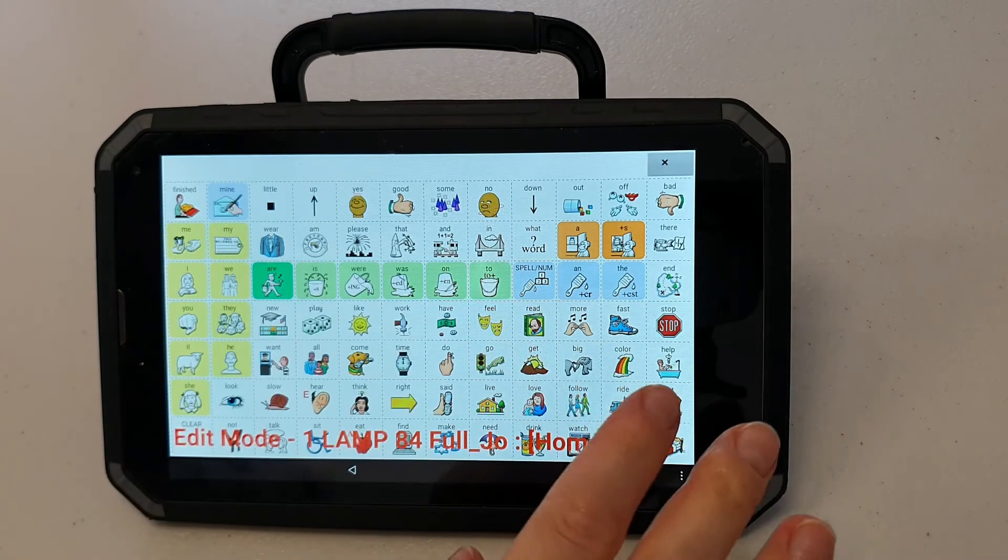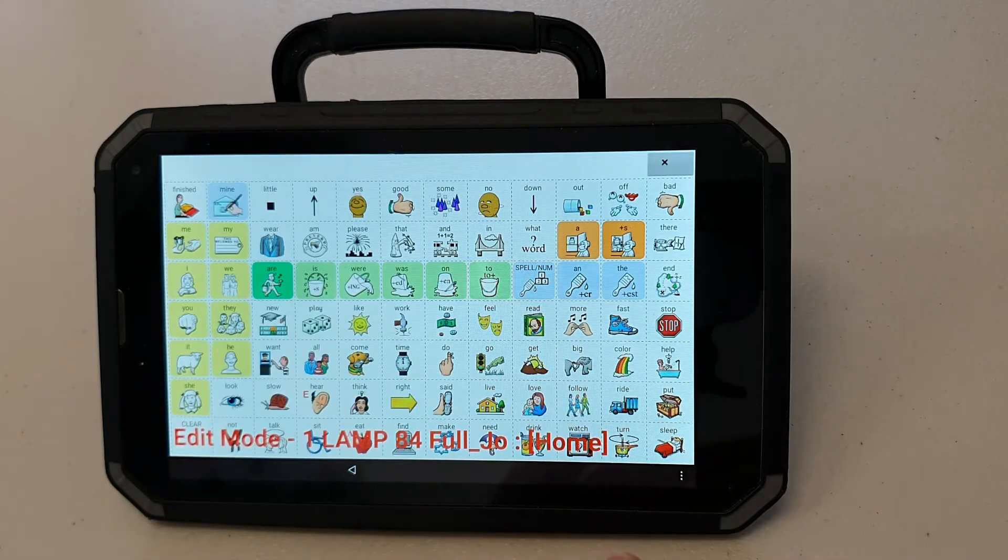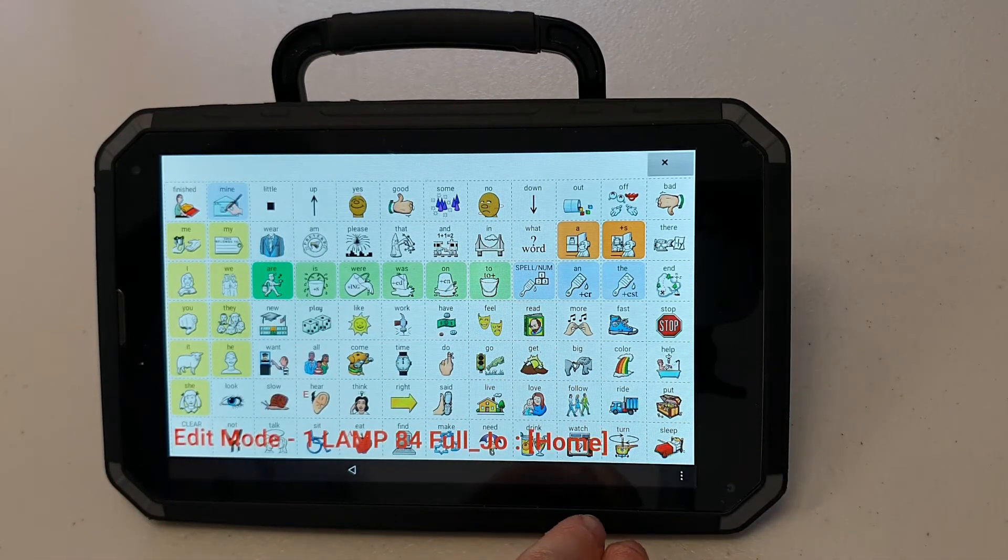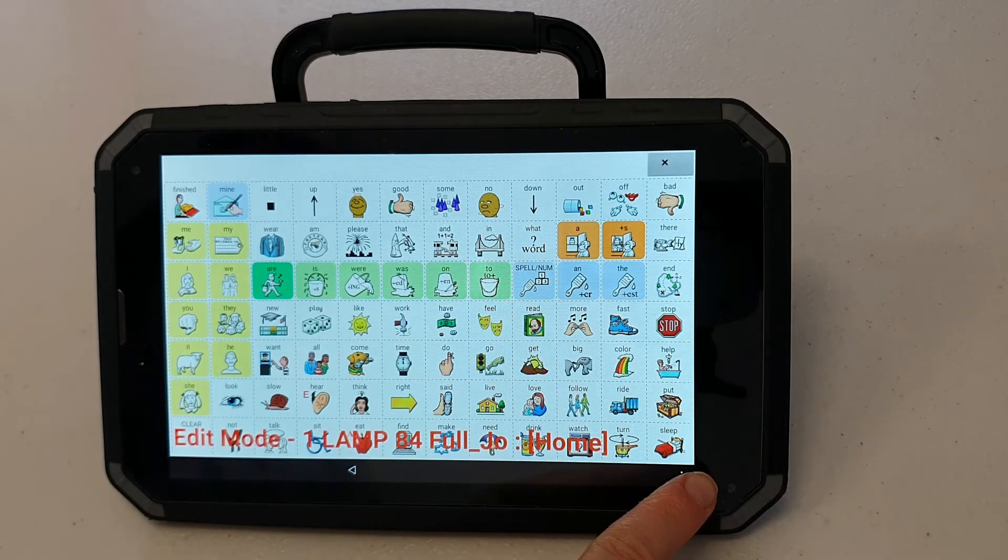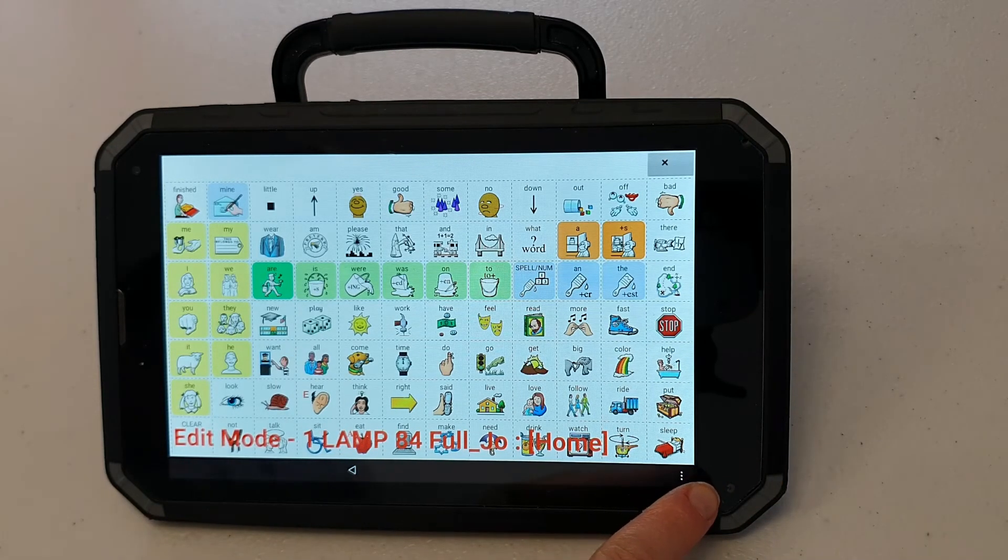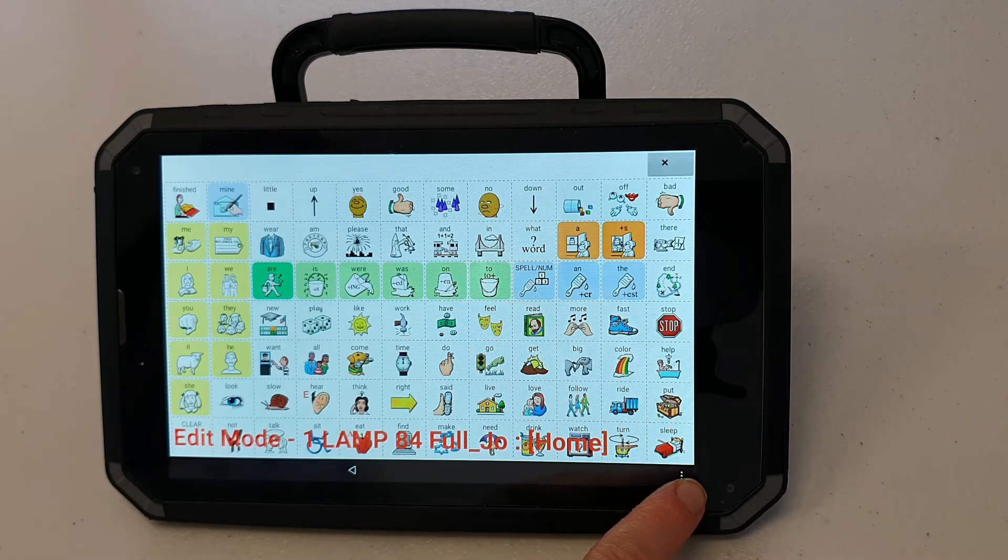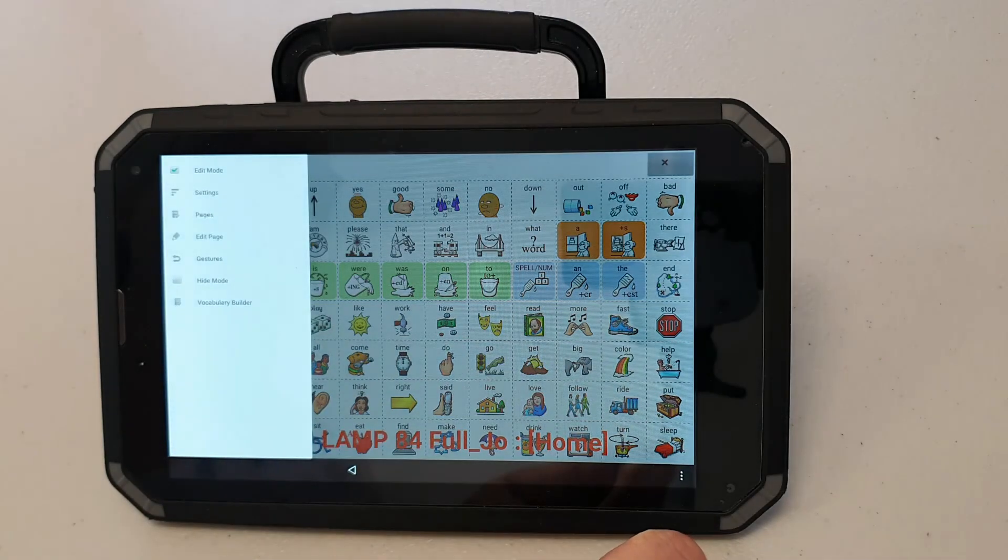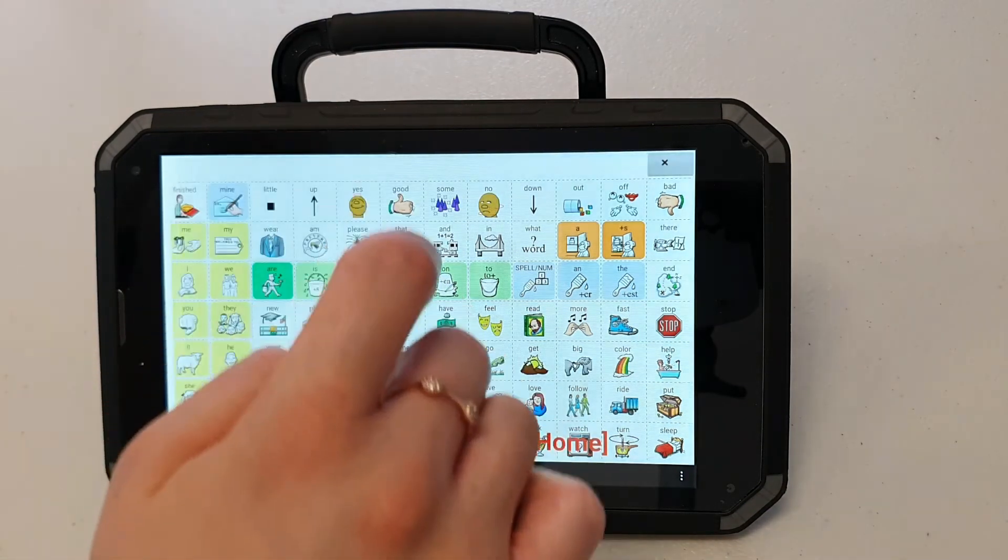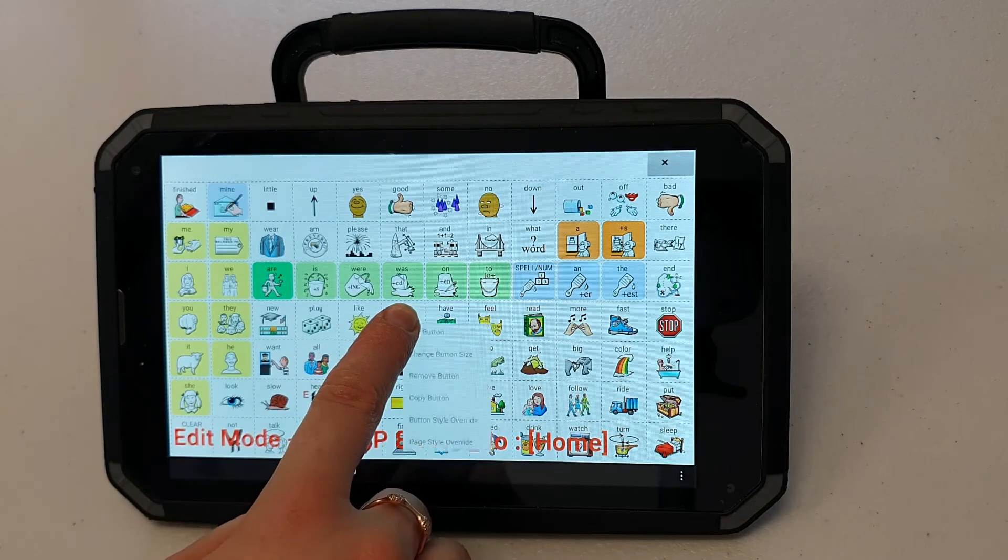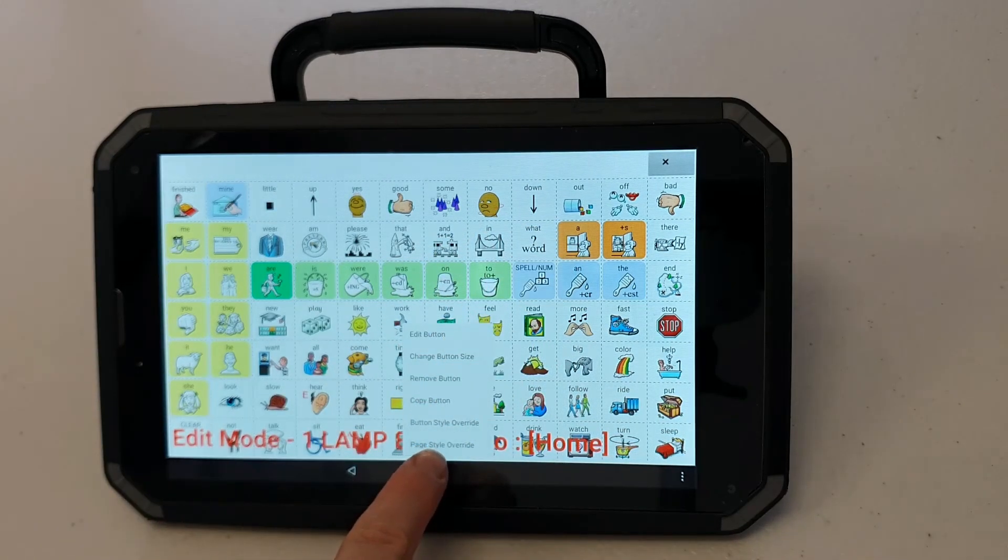If I want to change the color of the background that can be helpful especially when the vocabulary builder is turned on and I want my buttons to stand out against potentially a dark black background. I can do that by pressing my menu button, making sure edit mode is turned on, holding down any icon, pressing page style override.